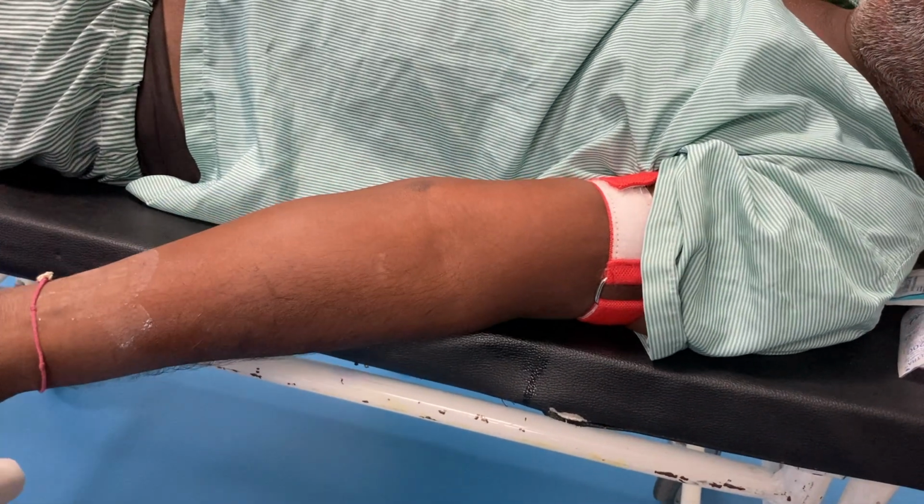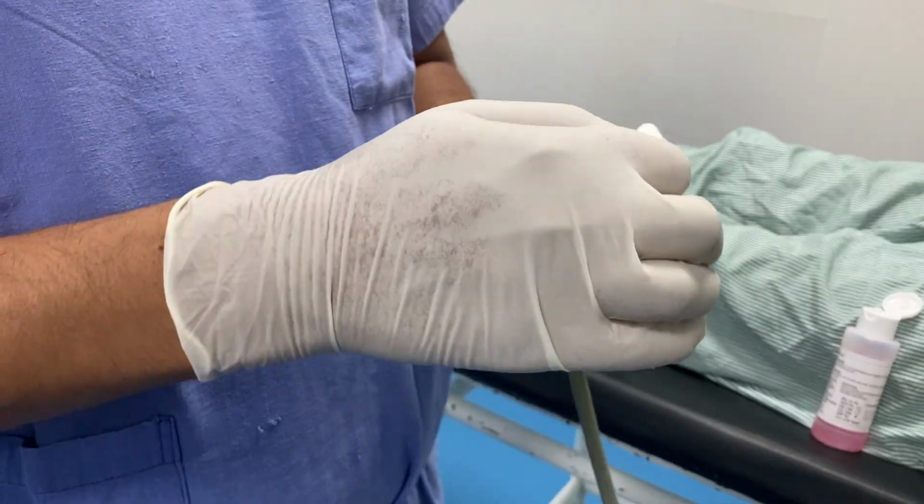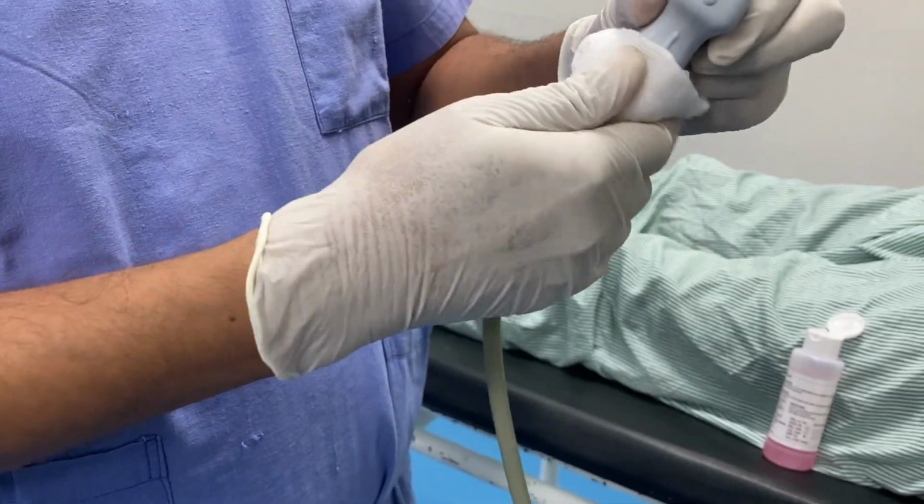Now next, before using the high frequency linear probe, we have to clean this probe using the alcohol based solution.